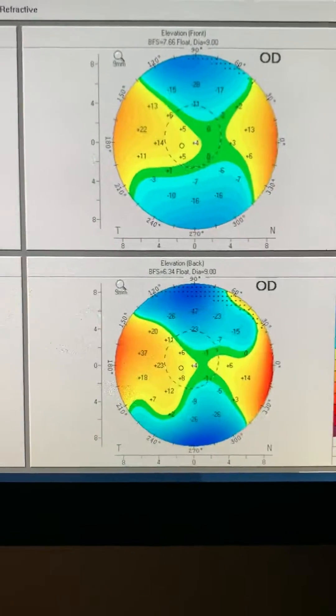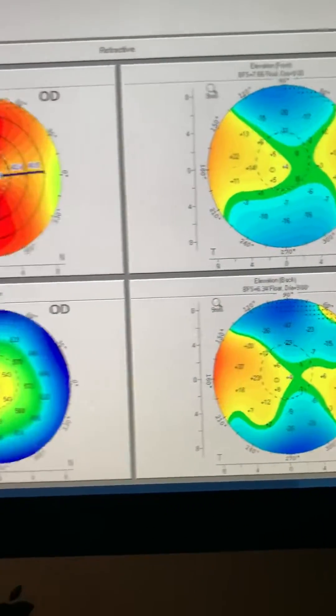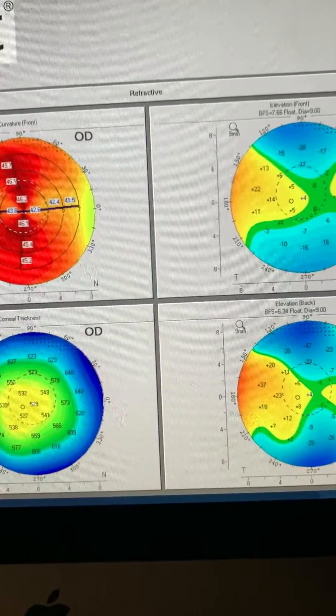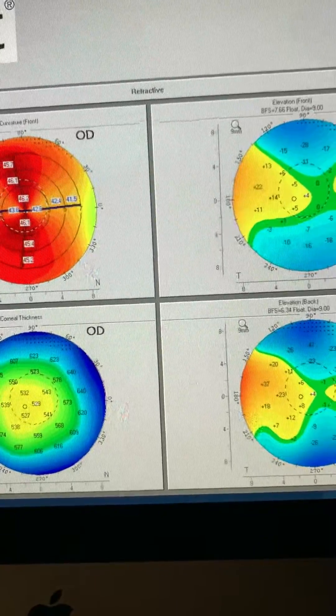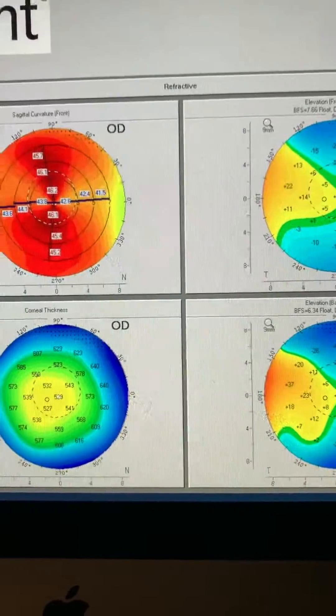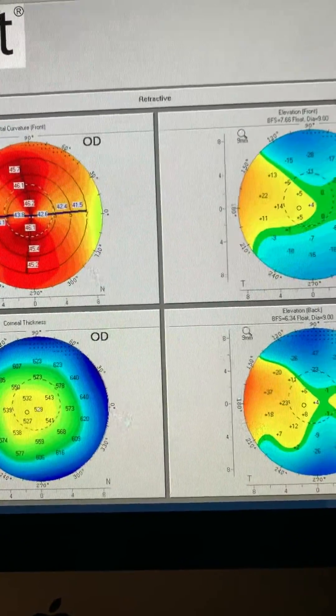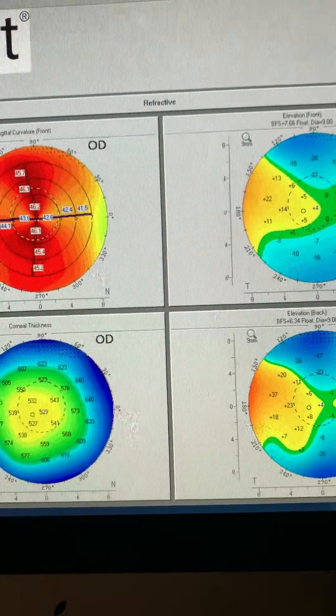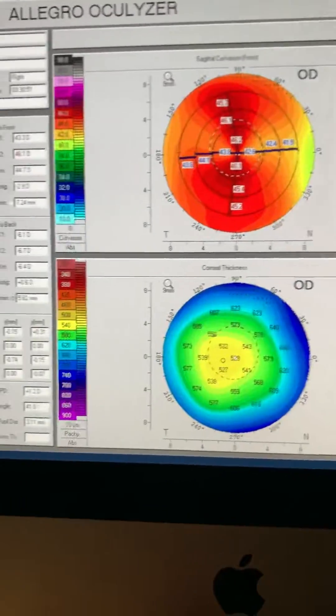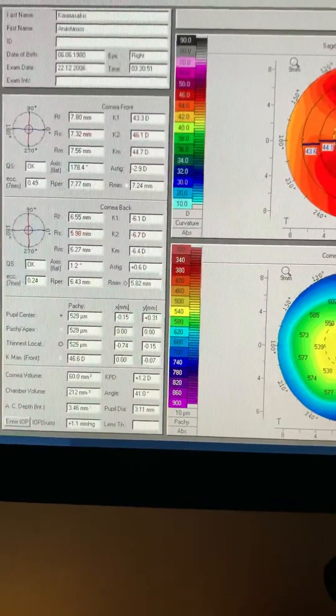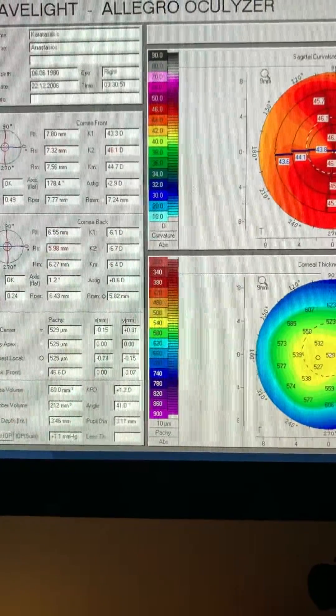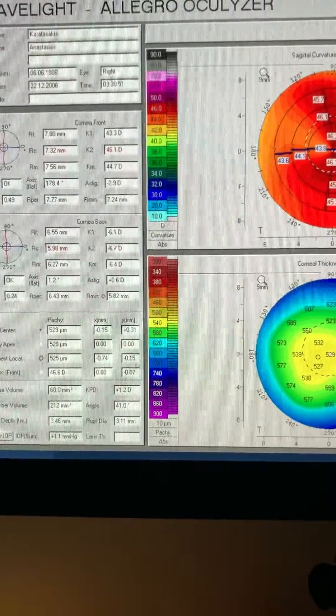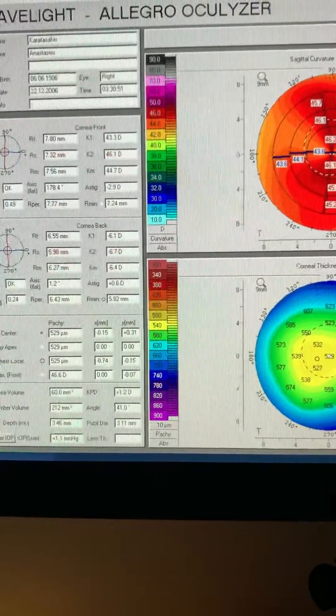The posterior float looks absolutely normal. The patient underwent an uneventful LASIK procedure with Moyer Keratome, at the time 130-micron flap, and the Wavelight Allegretto 200 hertz at the time.